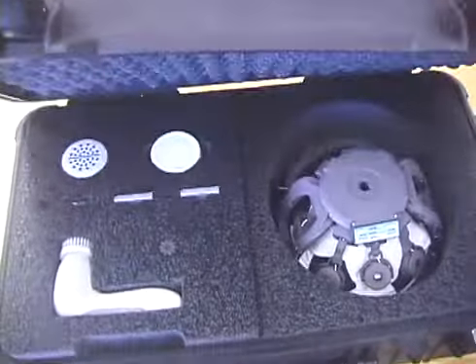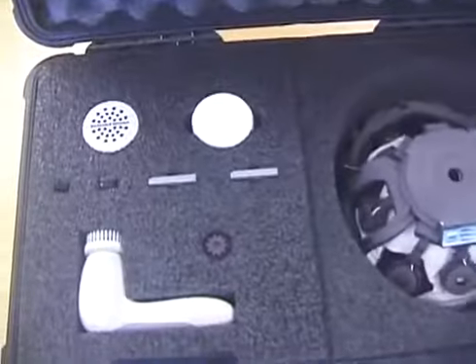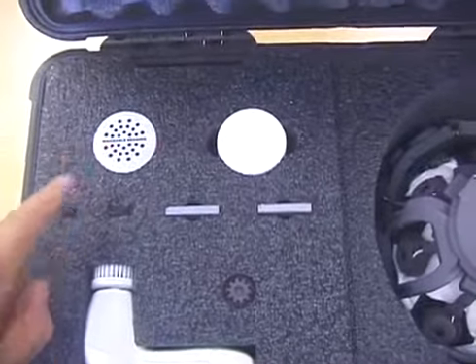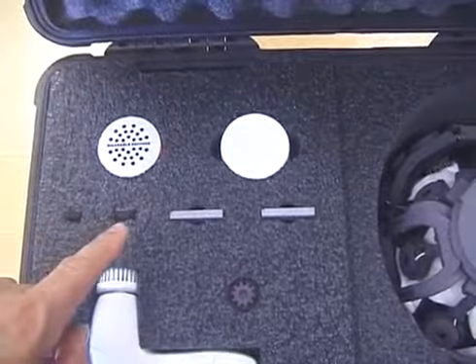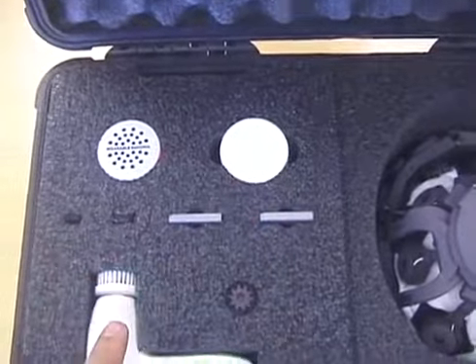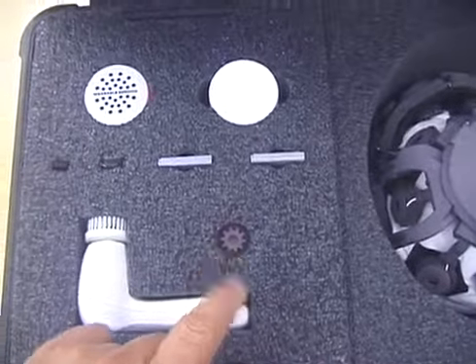Inside the ruggedized case for the DSi24 you will find a tape measure for measuring the circumference of the subject's head, a Bluetooth dongle, a USB flash drive containing software, two batteries, some cleaning fluid, a motorized cleaning brush, and the adjustment tool for the electrodes.